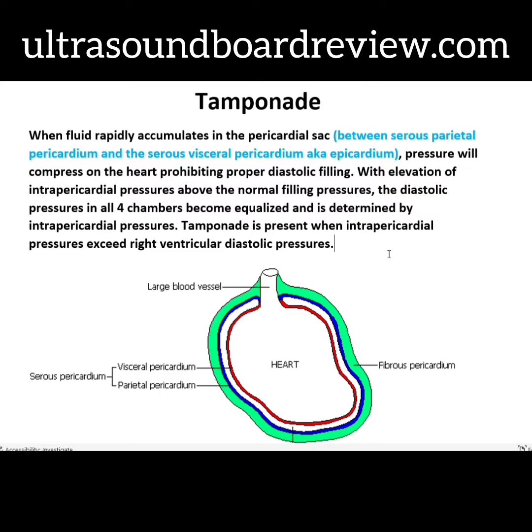You can have a large pericardial effusion that builds slowly but will not show signs of tamponade. It's important to know that with tamponade, you can only diagnose this condition clinically. And we use ultrasound to confirm what was found clinically.